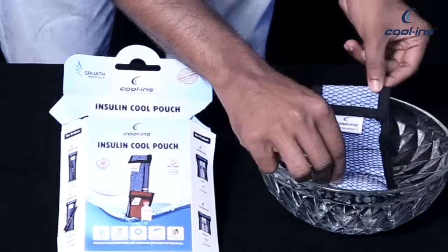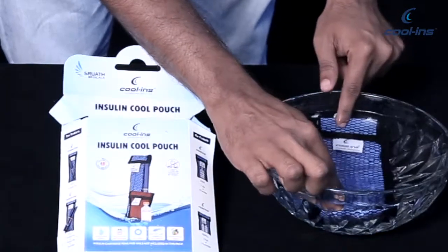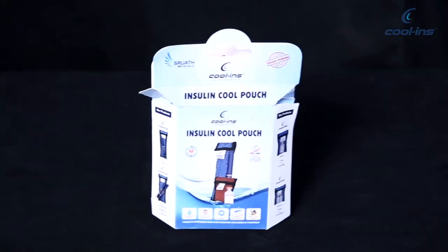It can simply be reactivated by immersing it into water whenever you want to use it again.